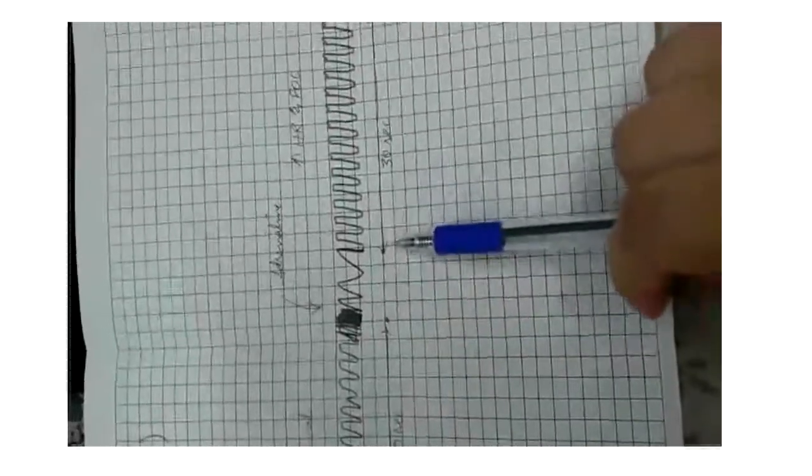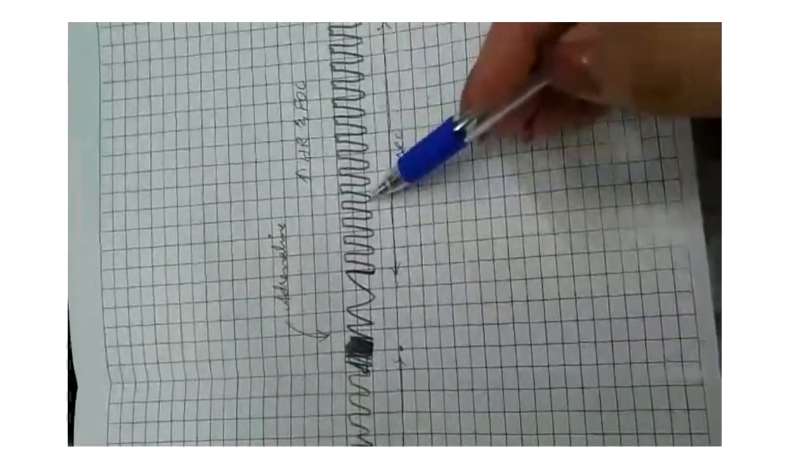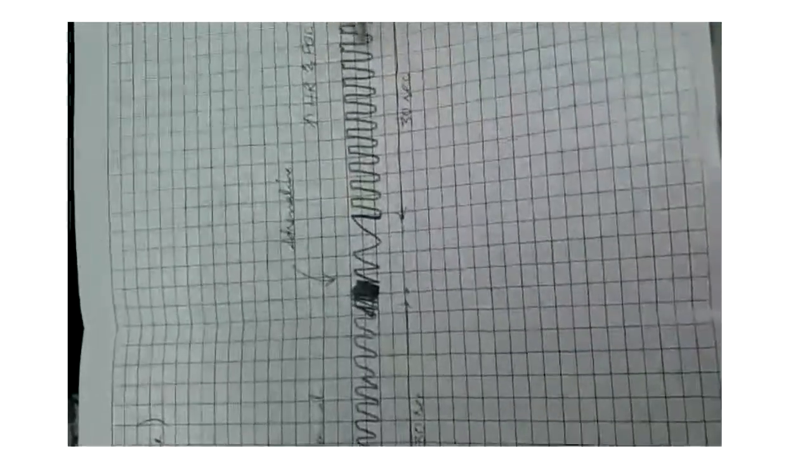You will compare the reading after adding the drug with the normal one. So the height of contraction indicates force of contraction, and the distance between each contraction indicates the heart rate. So you know that heart rate and force of contraction is increasing here. That means that this must be a stimulatory drug. So we assume that unknown drug is adrenaline.